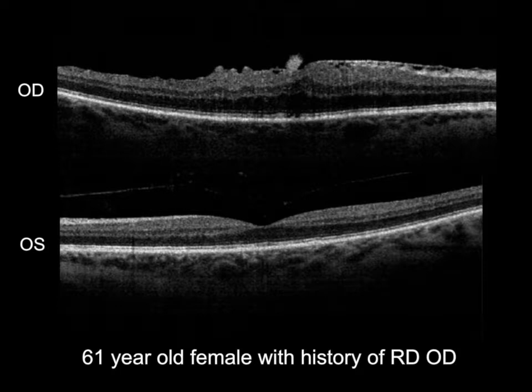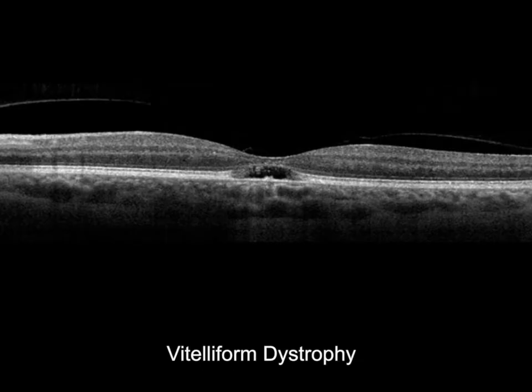But barring similar appearances over time when we scan these patients, because that's what we're really doing, we're watching these individuals, and barring any changes in visual acuity, we're managing these patients in our offices. What we're simply doing is referring them to retina when need be, or when there is a change in the appearance of the retina, or when there is a change in vision. Whereas prior to OCT technology, we were really looking at referrals to retina when there was a change in visual acuity that was unexplained. Other conditions that you'll see in the practice and that you'll start managing, because retinologists will give you, not necessarily the freedom, but you'll feel comfortable monitoring these.